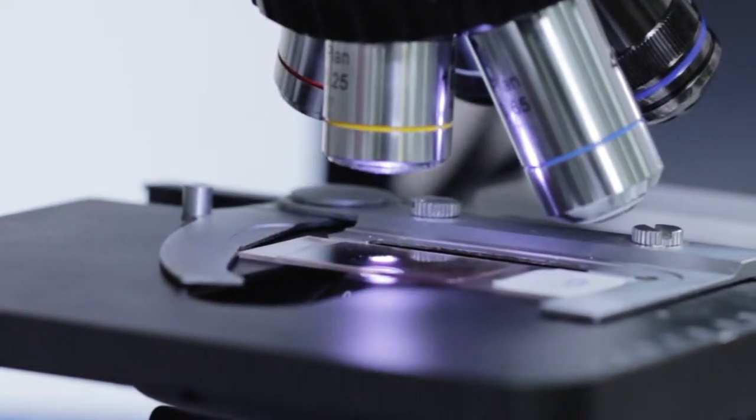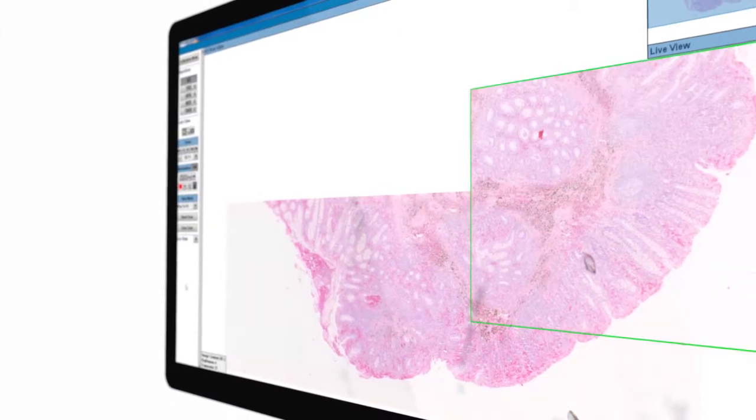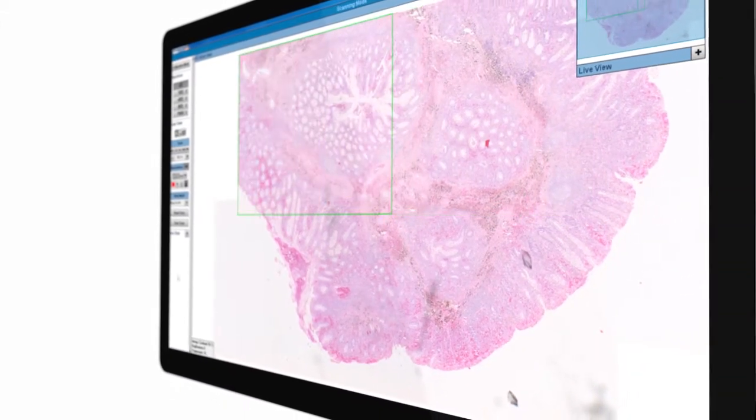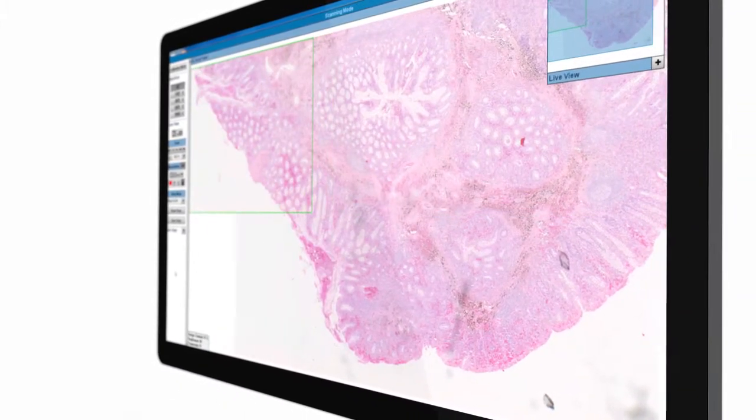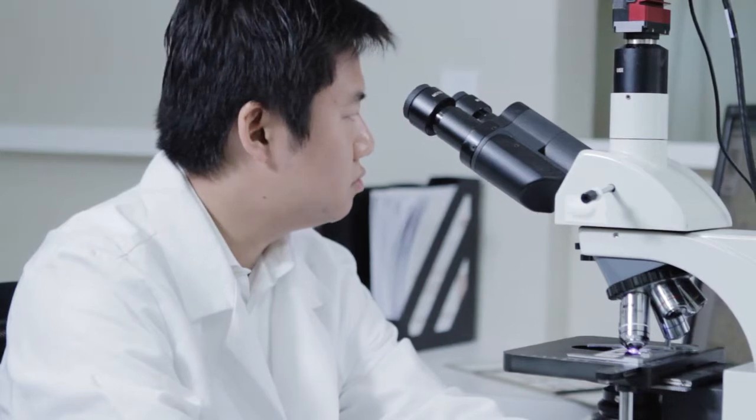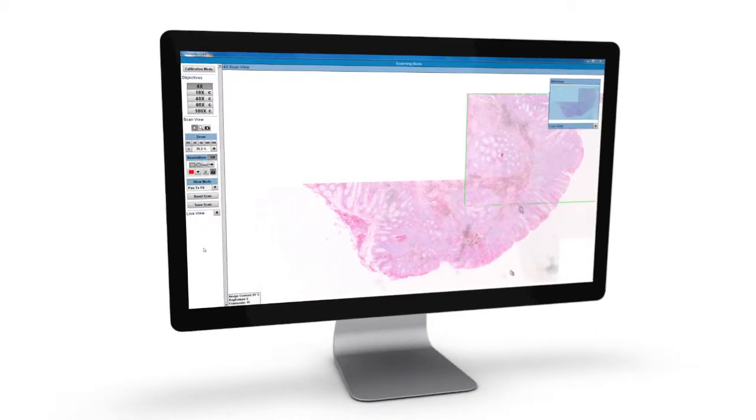we've created a new way to digitize glass slides. Our solution, called Panoptic, wraps around your existing microscopy setup, making integration seamless.